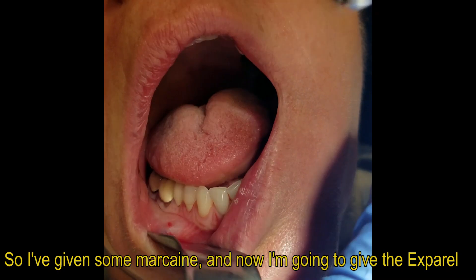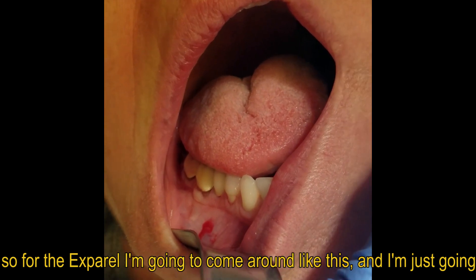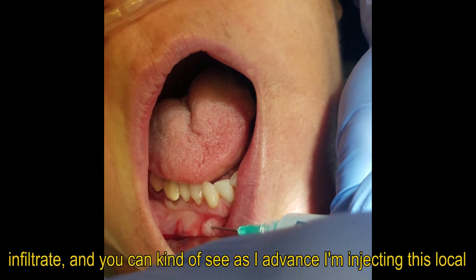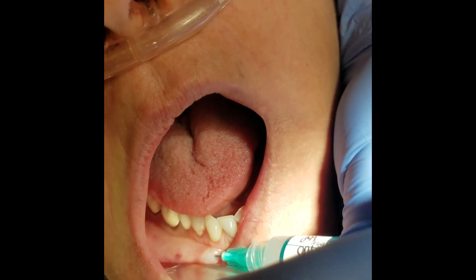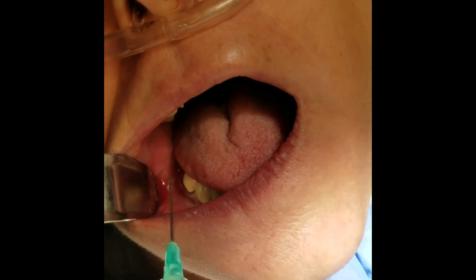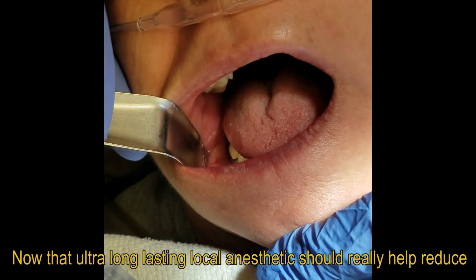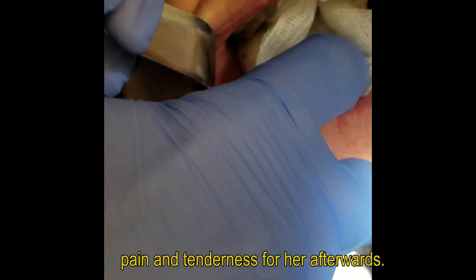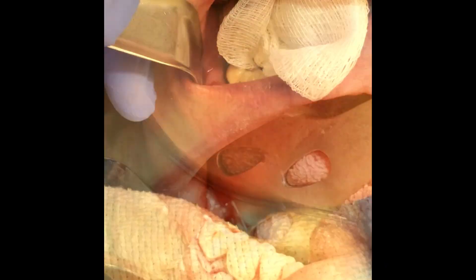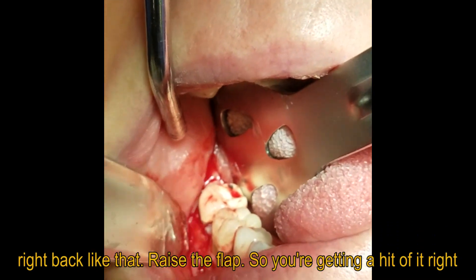Let's do it. I've given some Marcaine and now I'm going to give the Exparel. For the Exparel, I'm going to come around like this and just infiltrate as I advance, injecting the local anesthetic. This ultra long-lasting local anesthetic should really help reduce pain and tenderness for her afterwards.